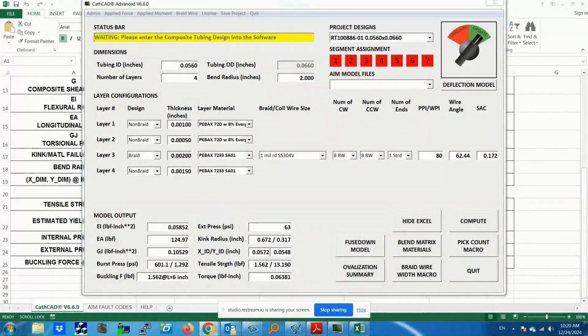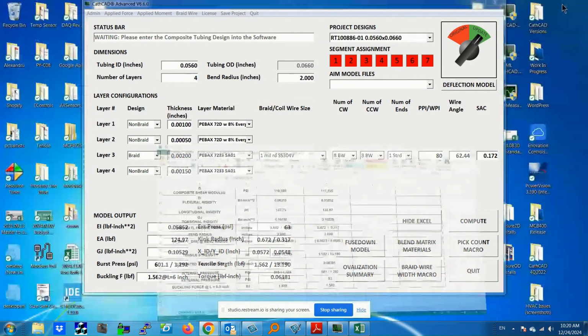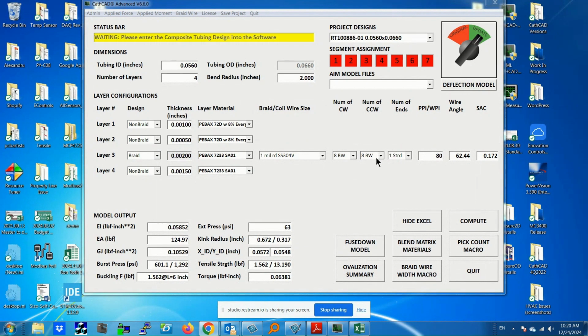So again, here we are looking at our design, and now we want to determine in this design, do I have the right braid density? The way of doing that, typically once a braid wire has been selected, is to look and maybe change the picks per inch. So that's this parameter right here. In the early versions of CathCAD, you had to manually type in this value and hit the compute button and basically iterate along the way. One of the things that we've made easy for the end user is this button called pick count macro.